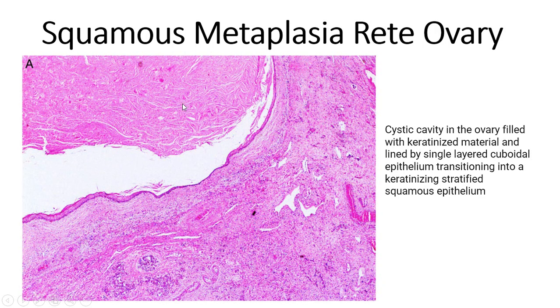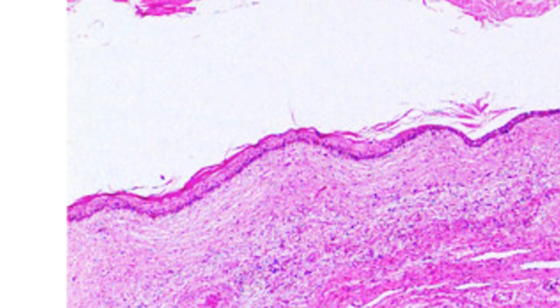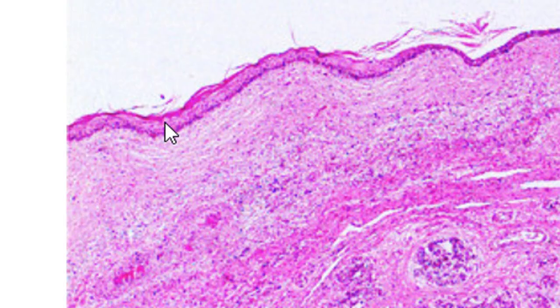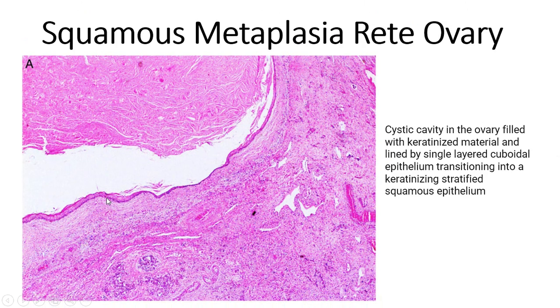Okay, so columnar type change to squamous type. So I will zoom this part here. Here, squamous cells. This is not normal. So it means it reflects the metaplasia. Columnar type or cuboid type change into what we call squamous cells.